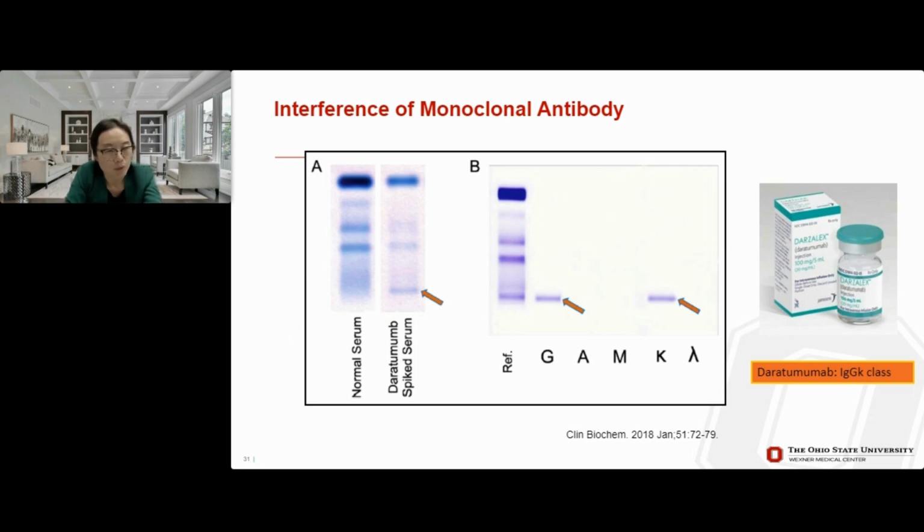Currently, most experience with monoclonal antibody therapies for multiple myeloma comes from the drug daratumumab. The possible interference from these drugs with M protein analysis is particularly relevant for multiple myeloma patients with monoclonal proteins of the IgG kappa or free kappa light chain subtype. In these patients, co-migration of the therapeutic antibodies and the malignant M proteins may hamper the correct assessment of the malignant M proteins by SPEP or IFE or IT.